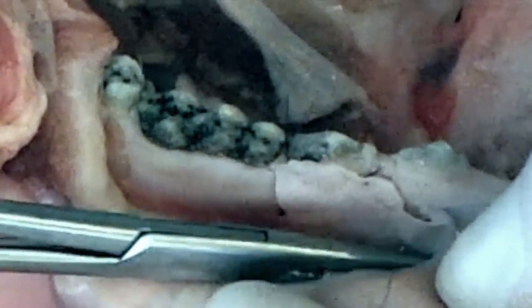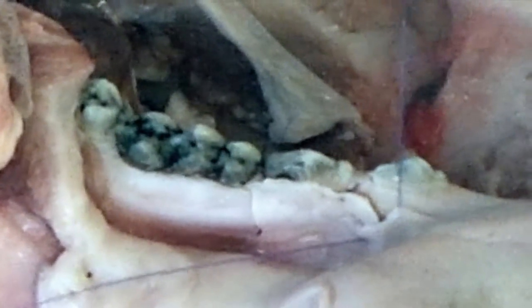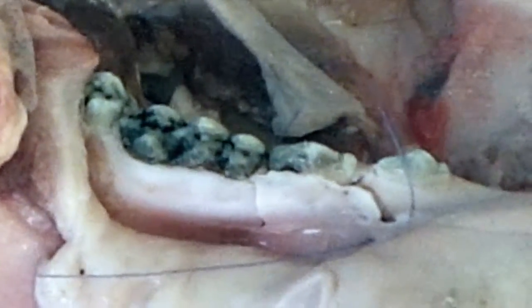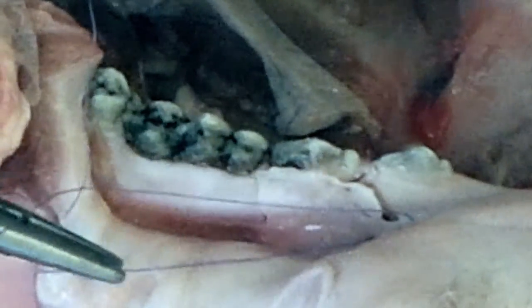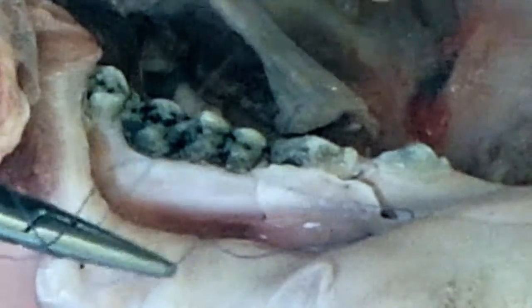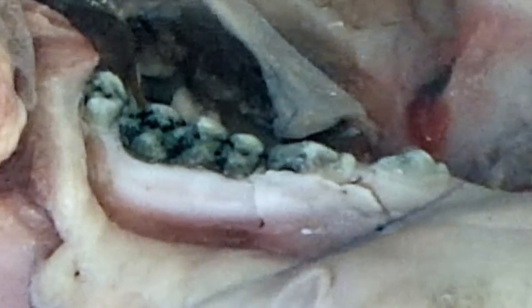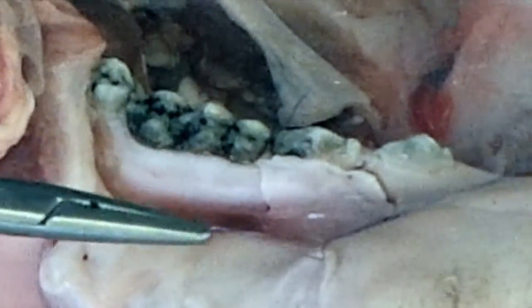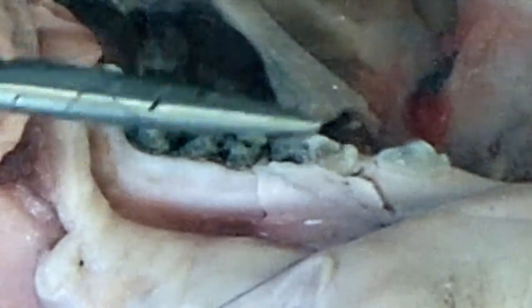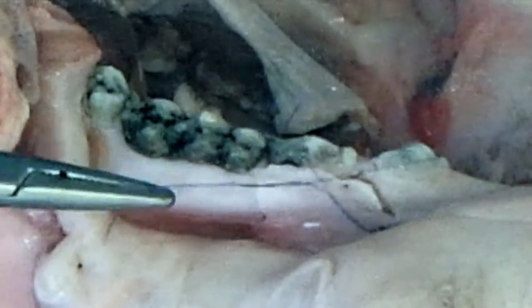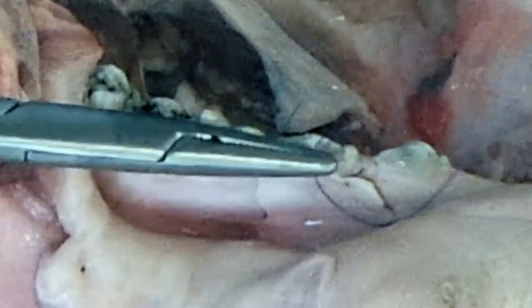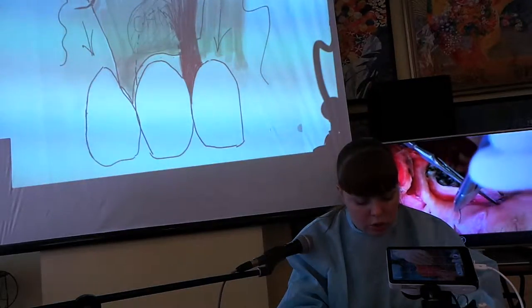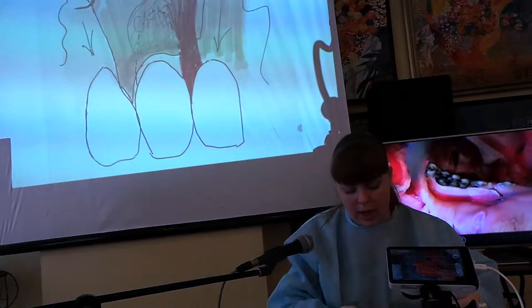Таким образом, вы фиксируете слизисто-надкостничный лоскут, который вы мобилизировали, к надкостнице в новом положении, что препятствует его апикальному смещению, расхождению швов и созданию натяжения в послеоперационном периоде, которое будет вызвано отёком мягких тканей лица. В дальнейшем проводится ушивание вертикальных разрезов.